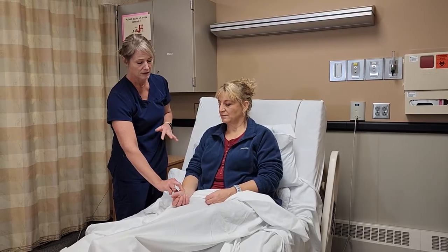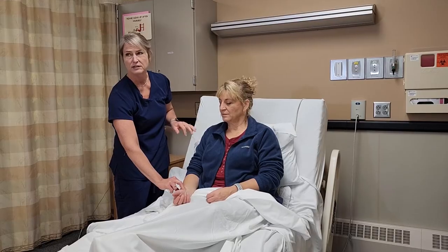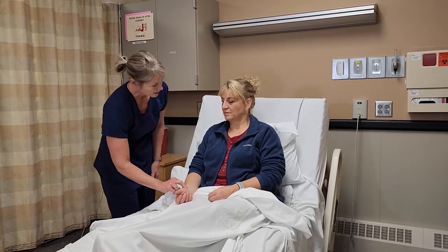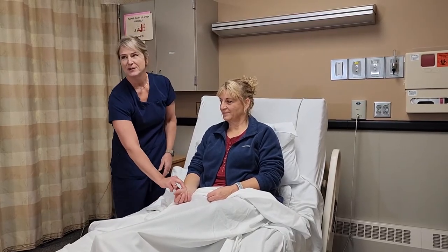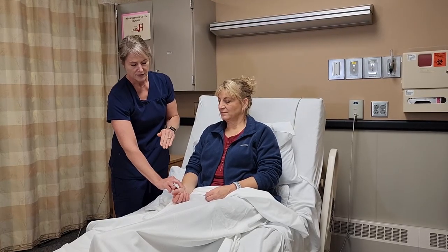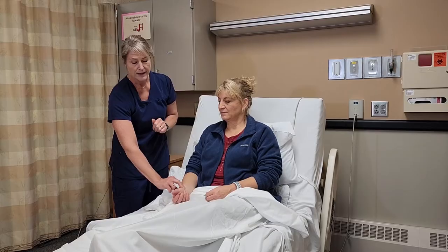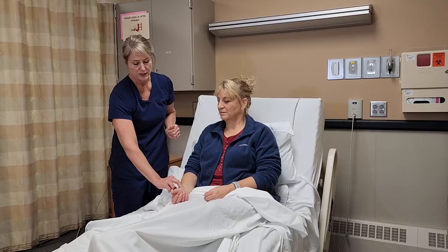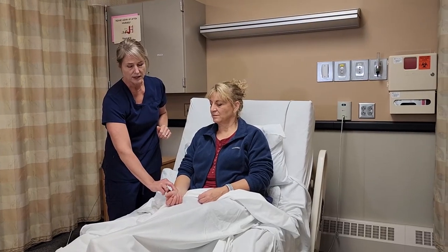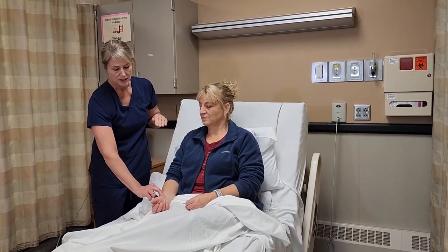As I'm counting the beats, I'm also going to use my eyes to watch where I can see her chest rise and fall, or her stomach. I don't want to stare at the resident when taking respirations — I want to use my peripheral vision. When I've counted the pulse for 30 seconds, I'll keep my hand there and count the respirations using peripheral vision, watching the clock at the same time.